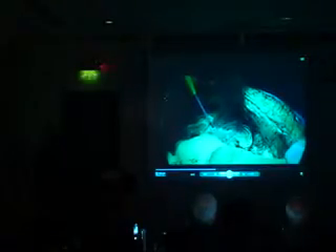The electrosurgery is on pure cut at high voltage. It gets too hot if you don't frequently irrigate with room-temperature saline. The saline irrigation is good not only in that it cools down the sites — especially if you're working around tubular structures — but it clears away the debris so that you have complete visualization of the operative site.